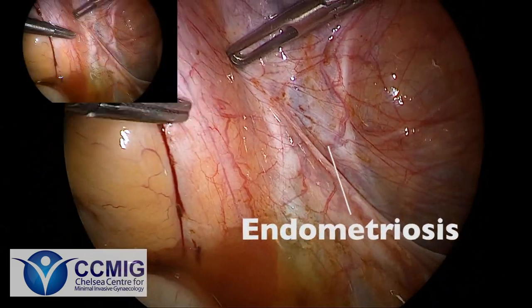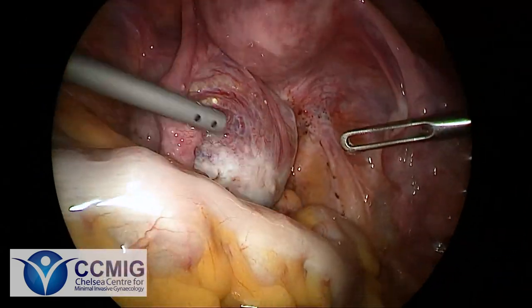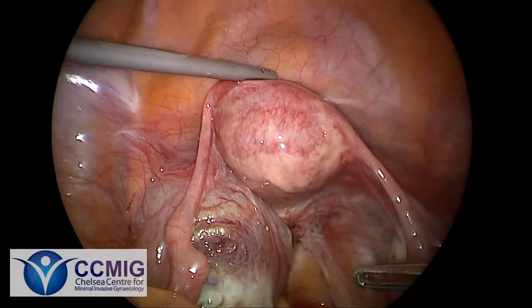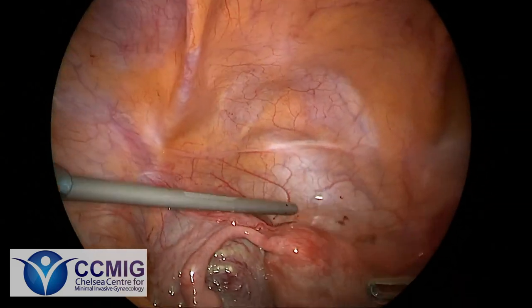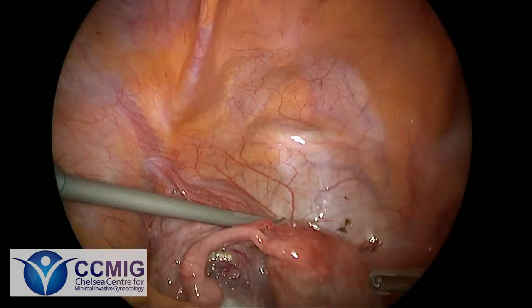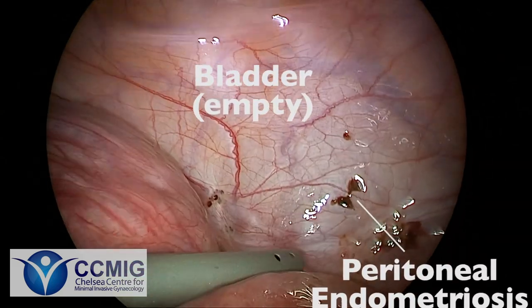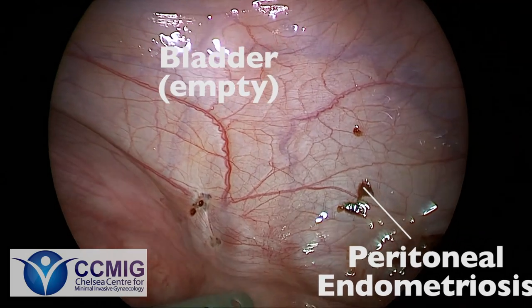Zooming closer in though, we can see peritoneal deposits here on the right pelvic side wall. And when we look on the front, between the uterus and the bladder, we can see deposits here on the peritoneum.